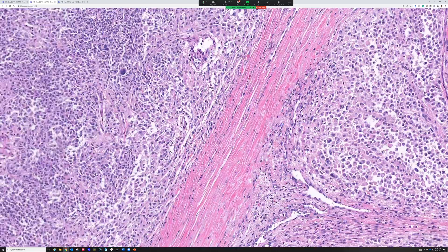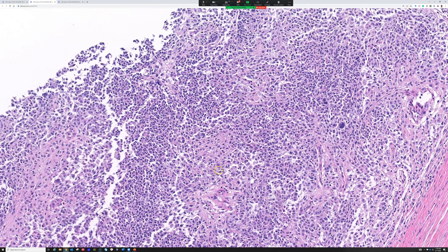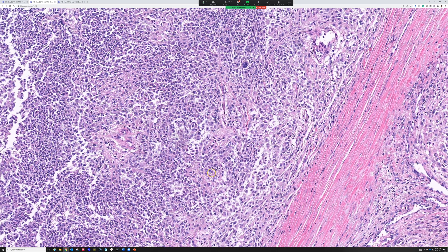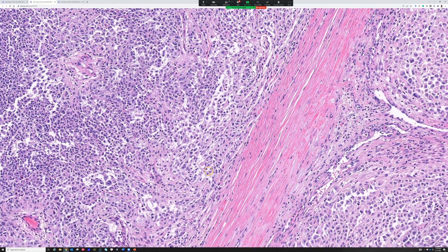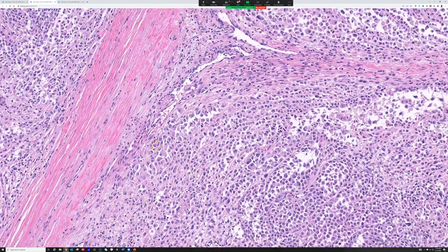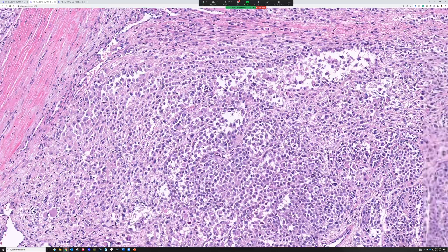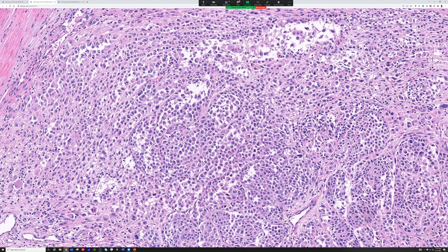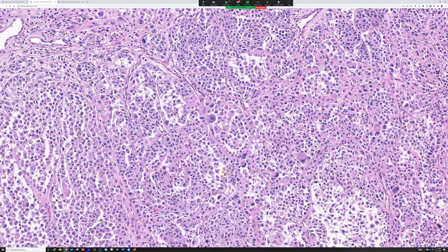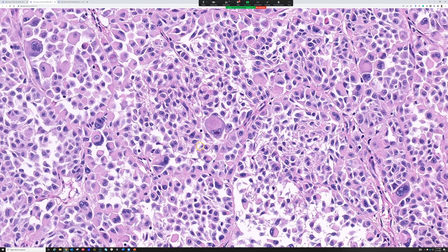INI-1 is retained here and keratin is negative. You could also think of rhabdomyosarcoma — some have rhabdoid-looking cells, particularly the epithelioid type. But true rhabdomyosarcomas will have retained INI-1 and expression of Desmin, myogenin, and MyoD1, which are nuclear markers of skeletal muscle differentiation. Those were negative here. This was positive for SOX-10, S-100, and MART-1 — so this actually is metastatic melanoma.